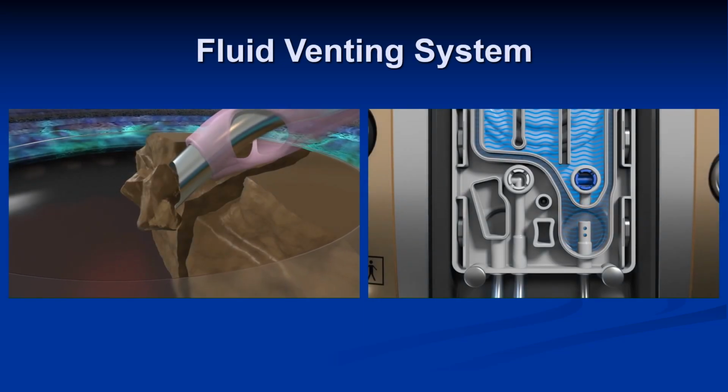Venting is the system that reduces vacuum when we stop aspiration, or when an occlusion break occurs. Venting helps reduce surge. Most modern machines utilize fluid venting by opening the vent valve inside the cassette. This will allow the irrigating fluid to go into the aspiration side to reduce vac.